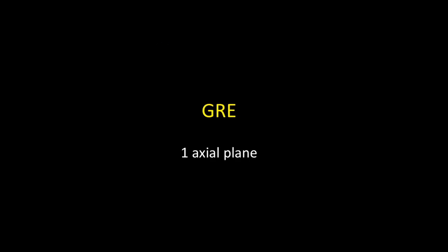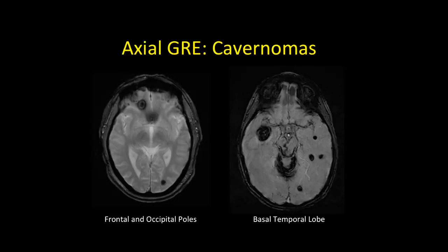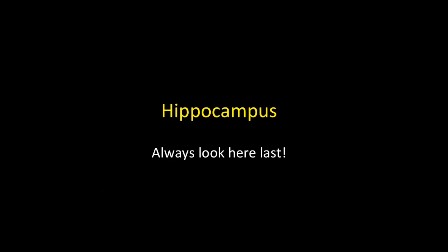Last sequence — gradient echo or SWI — just one axial plane, primarily looking for cavernous malformations. Here's one patient with cavernous malformations at the frontal and occipital poles, and another patient with multiple cavernous malformations with siderosis from bleeding and lesions in the basal temporal lobes.